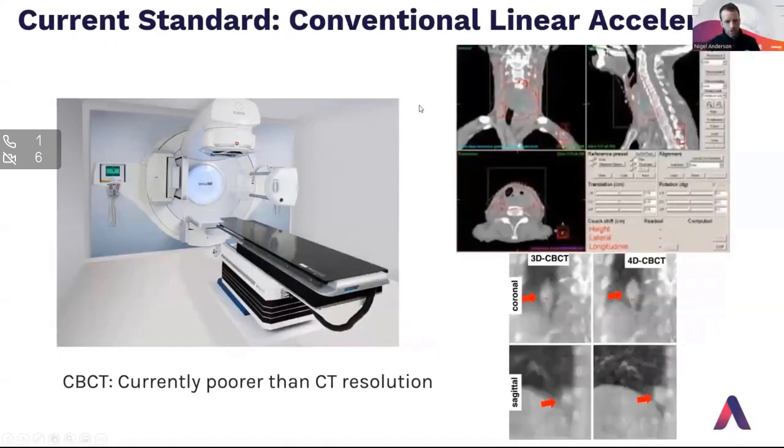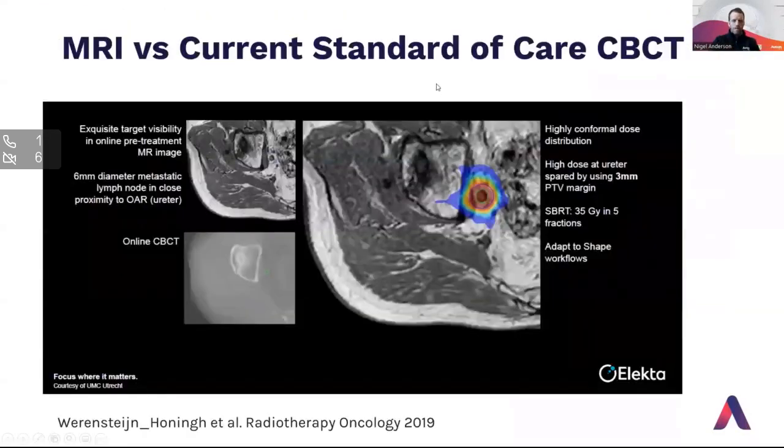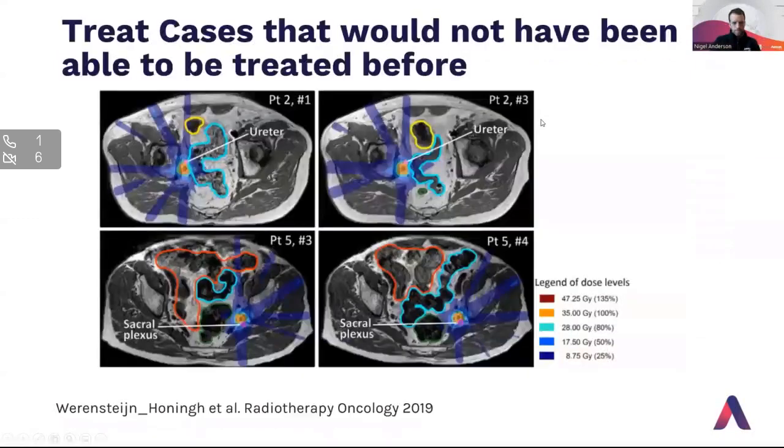I'm not going to go into the detail because I'm sure you're all aware of the benefits of MR guided radiotherapy, and in particular the difference between what an MR can offer compared to the current standard of cone beam CTs and the resolution that we see in that. So I don't need to preach to the converted. You're aware of the benefits of what we can see visually. What that enables us to do is see what we plan to treat a lot better, in particular on the day-to-day treatment fractions, and treat with far greater confidence in delineating and understanding what our target volumes are, but also those ever-important organs at risk that surround the targets as well. We all know that, but this has finally come to fruition, and we have this tool at our disposal, being an MR-Linac and an MR program, that enables us to do this.